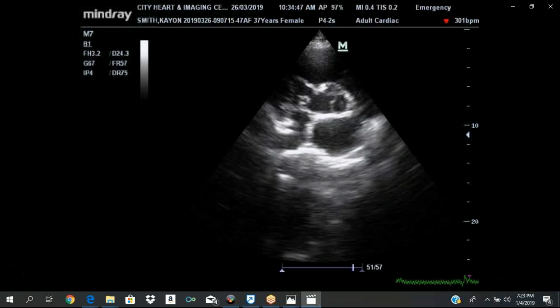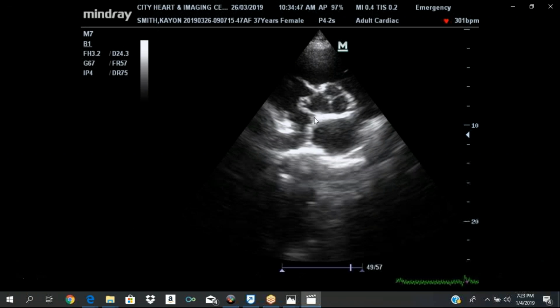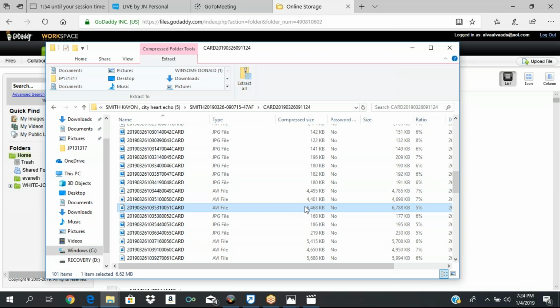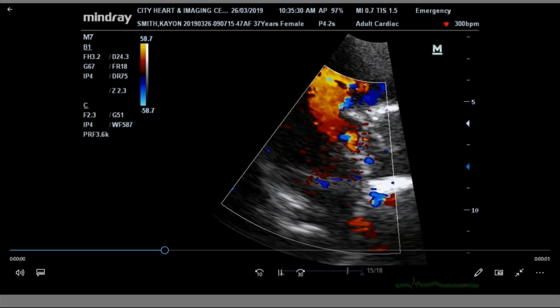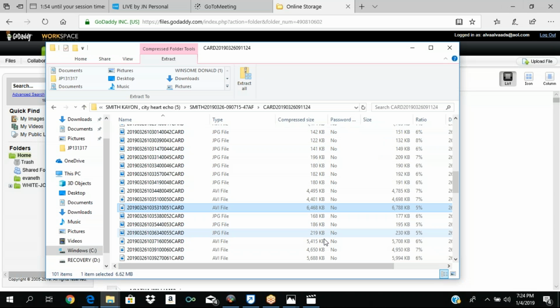There's a problem with this cusp. I don't know if you guys can see, but we're not teaching any pathology today. But this is our interatrial septum. Adjacent to that is your non-coronary cusp. So there's an issue right there. We're not going into that. This patient actually has a ventricular septal defect, but we're not teaching you guys any pathology today.